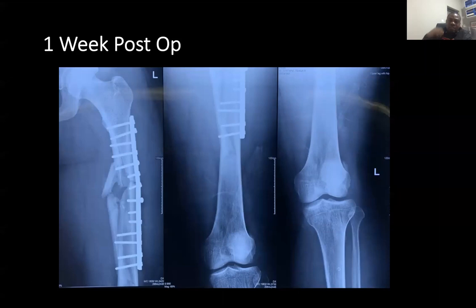Quickly, one student, can you tell us what you can see? Hello? Yes. Okay. I see post-op x-rays, AP, of the left femur, showing fixation. The problem, if you think there's a problem, if you think this is the same as the immediate post-op, then just say it, so that you catch up on time. I'm sorry, there was an interruption. I couldn't get the question. What is the problem, doc? Something is happening here. What is it?